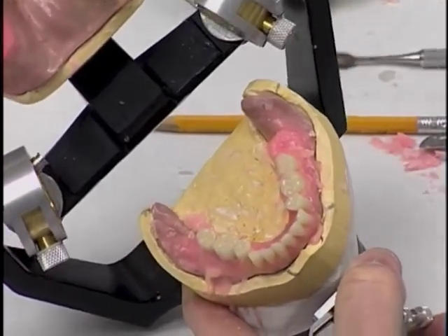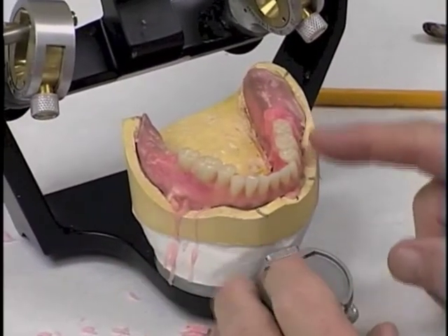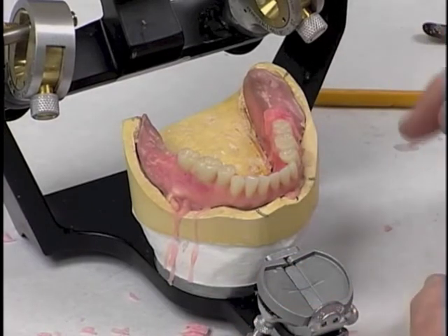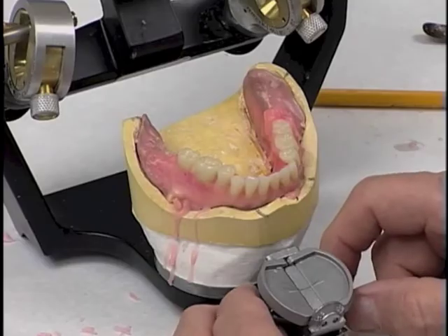Now we're just going to allow that wax to set until it's good and hard. And in fact, I'm going to dress this lower up just a little bit and get rid of extraneous wax that may interfere with the arrangement of the maxillary posterior teeth, so the wax is nice and smooth and all the teeth are stabilized.